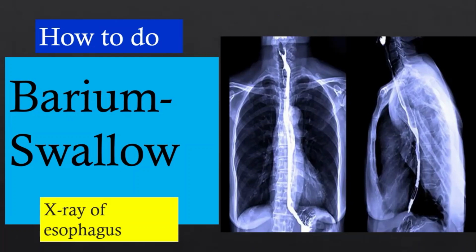Welcome to a new tutorial video, and it's a barium swallow, a contrast X-ray of the esophagus. So let's start.